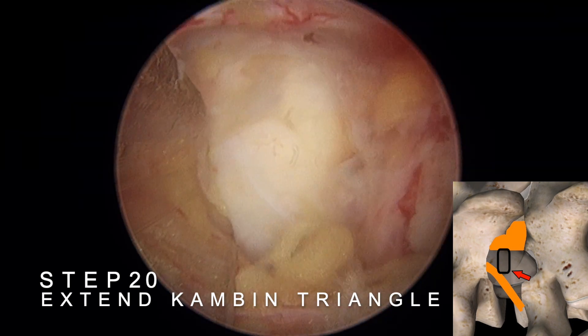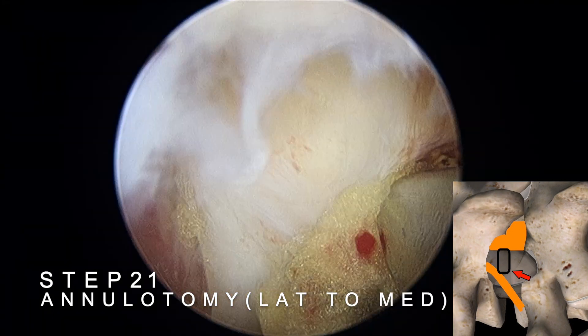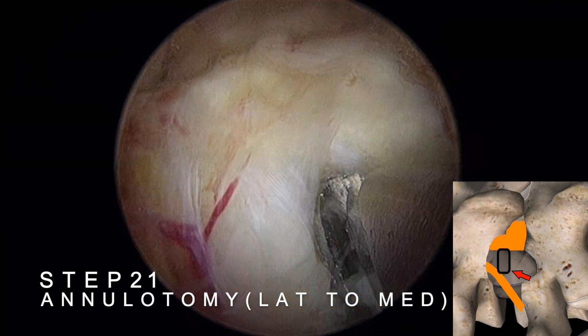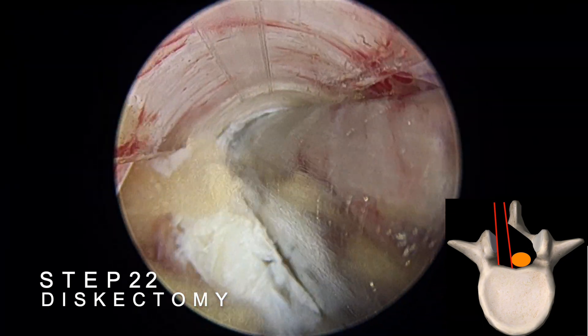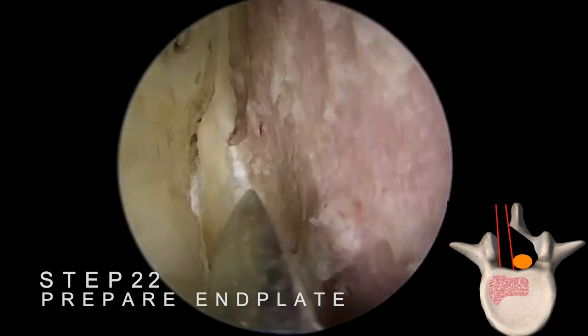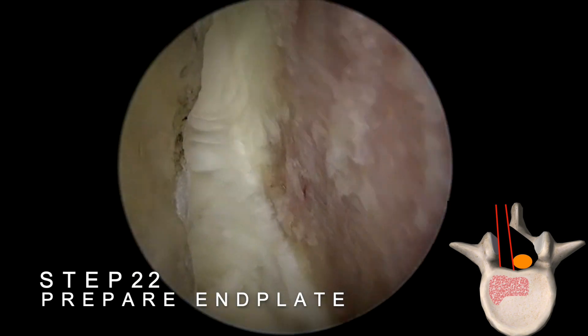Next, locate the Cambin's triangle between the exiting root and the traversing root, and gently mobilize both roots to create more space within the Cambin's triangle. Perform an annulotomy using the RF probe and Kerrison punch, progressing from the outer to the inner annulus. Perform the discectomy using an endplate separator to carefully separate the cartilage endplate from the bony endplate in one piece. Take care to avoid damaging the bony endplate to minimize the risk of cage subsidence later on.